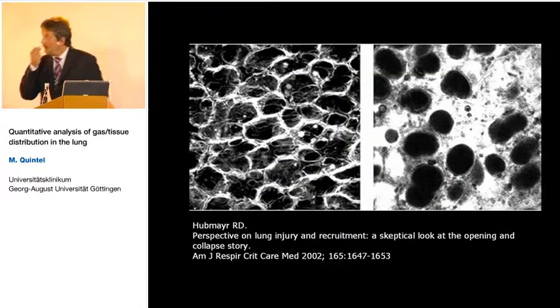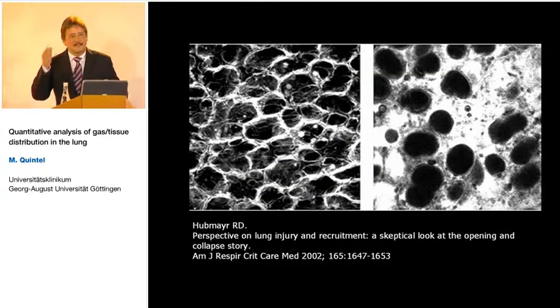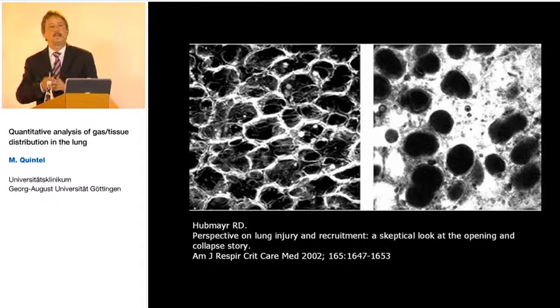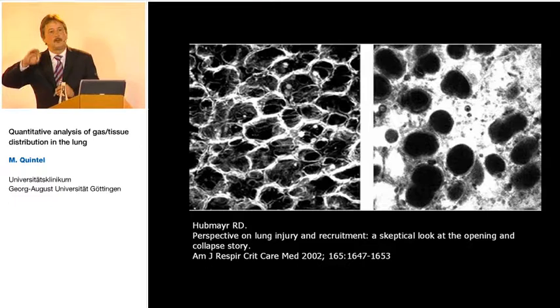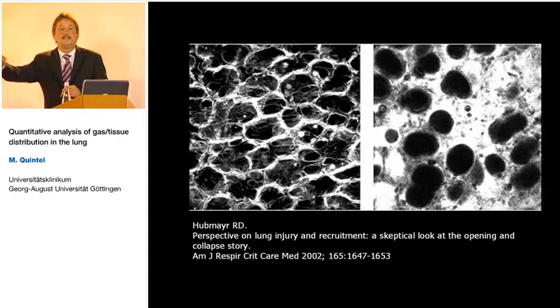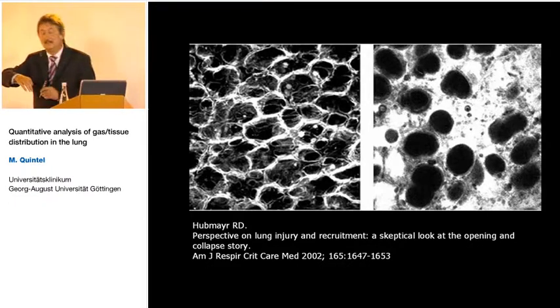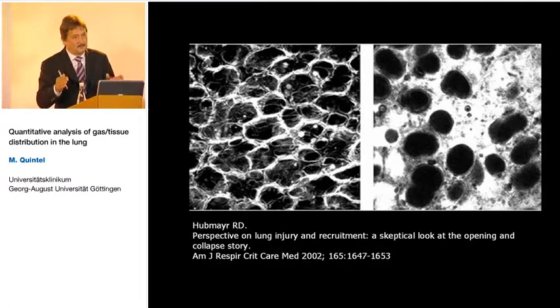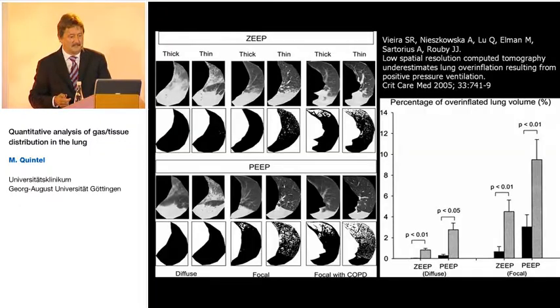Well, this is from Wolf, and this is again to make us aware it plays a role if we think of what we are applying to the lung, to look at what is really underlying. Is it more interstitial edema? Is it intra-alveolar edema? And we are normally not able to do this discrimination while using CT scan techniques.